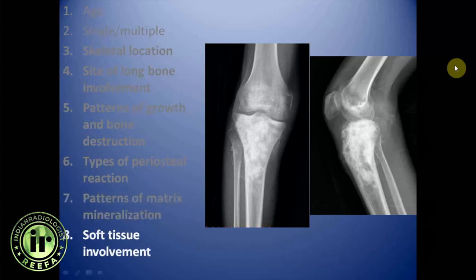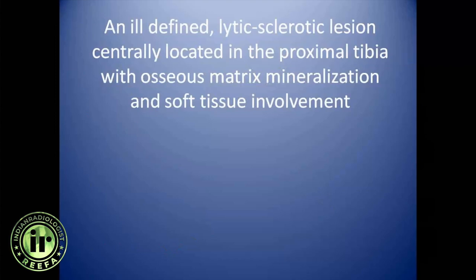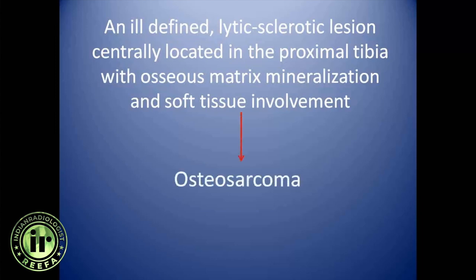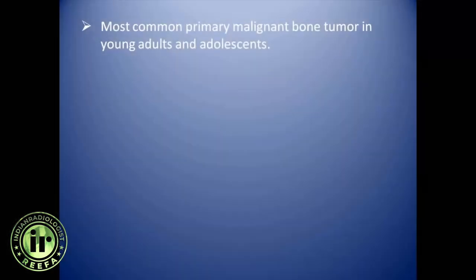The lesion has soft tissue involvement. This is a case of an ill-defined lytic-sclerotic lesion centrally located in the proximal tibia with osseous matrix mineralization and soft tissue involvement. This is the case of osteosarcoma, specifically conventional osteosarcoma.